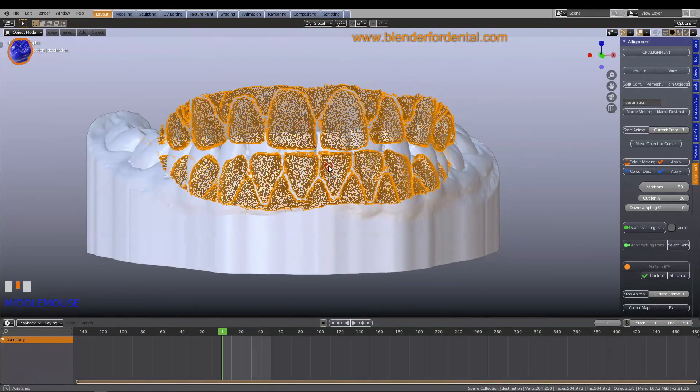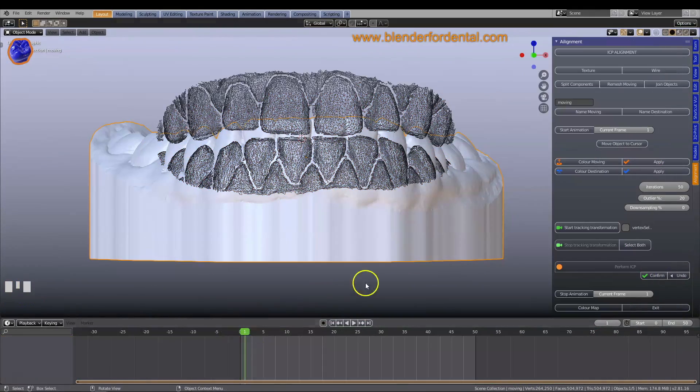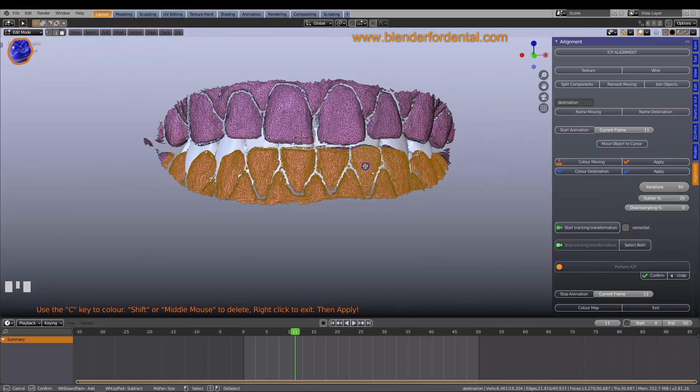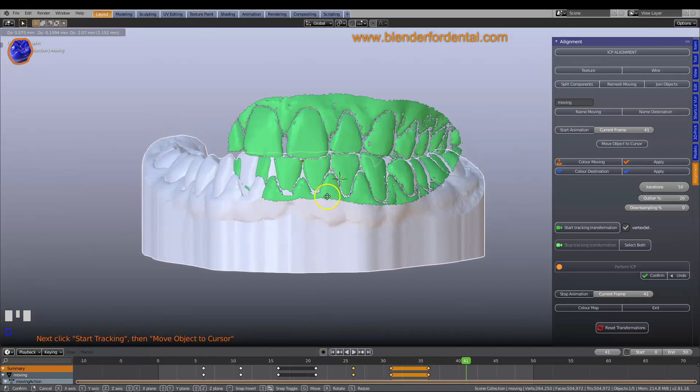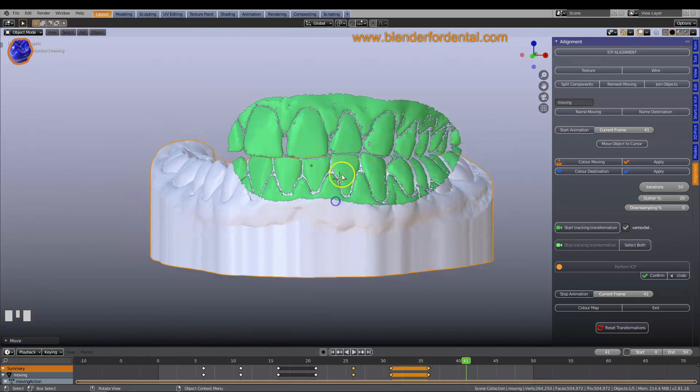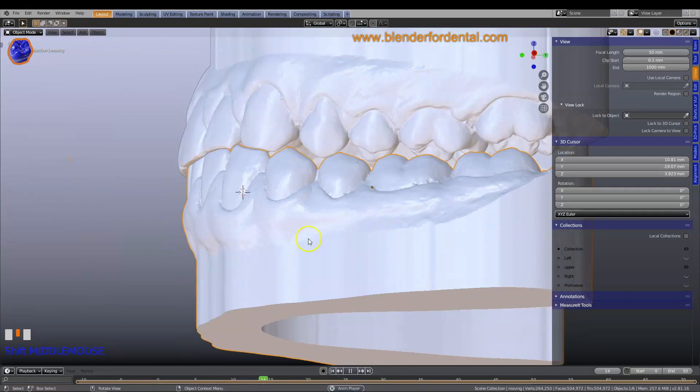You can use Blender's animation timeline to simulate the precise movement of the lower jaw by aligning the teeth to several buccal scans.